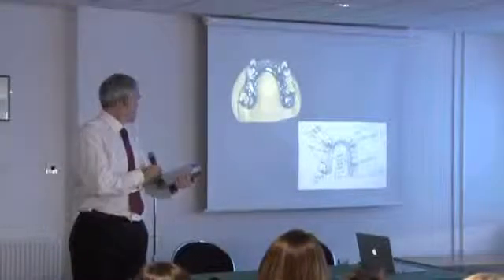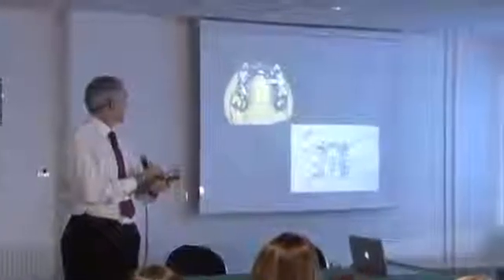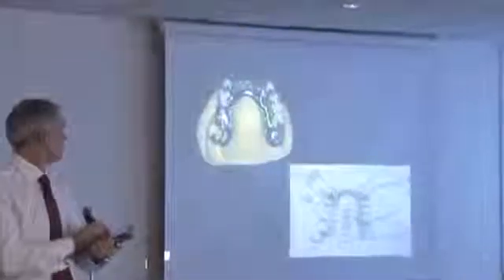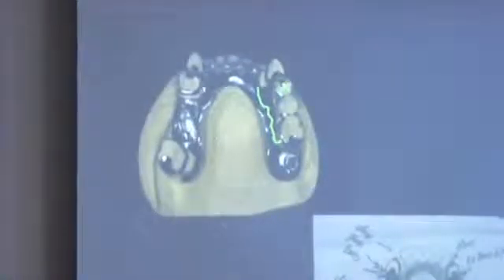The way this is designed is I've done it such that there's a plate all the way down here. So if any one of these teeth is lost, I can add to it. This denture would work the way I've designed it with just that tooth there and just that tooth there. It'll still work. So I'm planning for potential tooth loss. I don't think she's going to have much tooth loss now because the whole thing is stable. Once you stabilize things, they last longer.